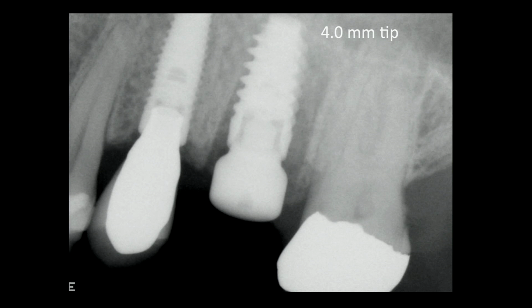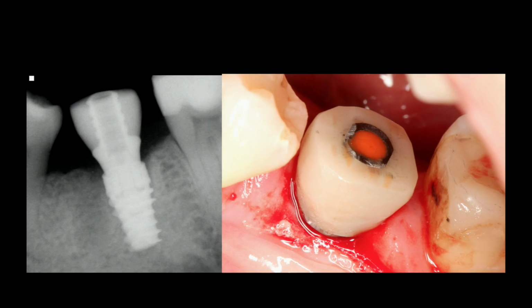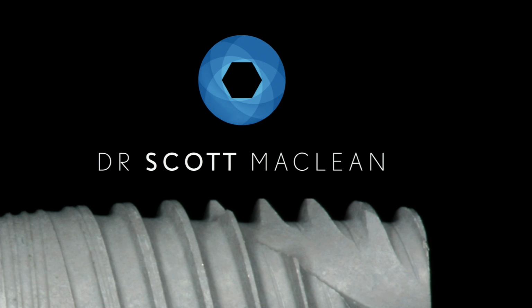Look at this case. I'm putting the implant in a little bit deeper than you would actually think. We want to be 3 millimeters below the free gingival margin on these cases, and then plan to stay close to the sinus, but this implant is using minimal bone to get a real great grab. If we go to the lower, we can see the same process. This is a lower that I've placed, and you can see that the bone around these implants is staying.